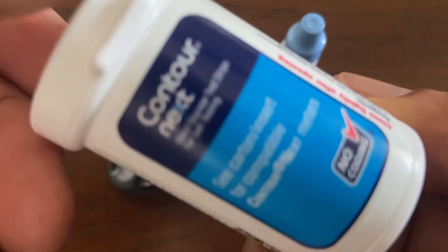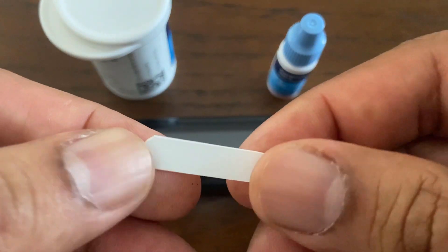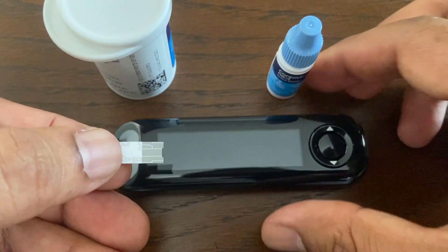The first step is to remove a test strip from the bottle. Use only Contournext test strips. The test strips are for single use only. Do not open the test strip vial until you are ready to remove a test strip and perform a test. Use the test strip immediately after removing it from the vial.